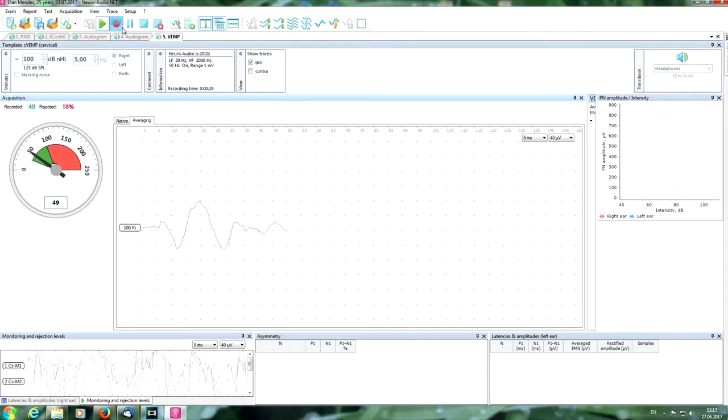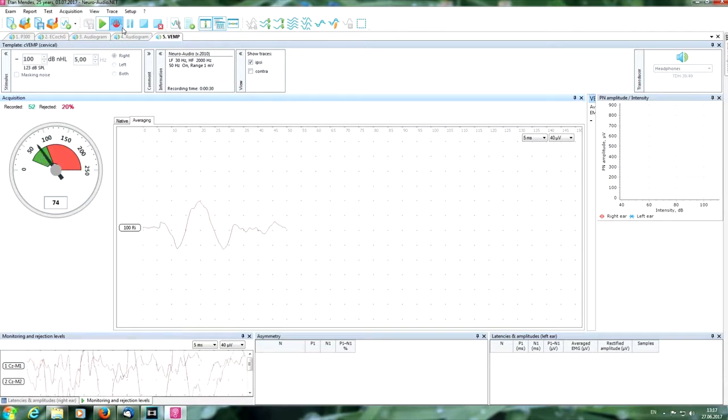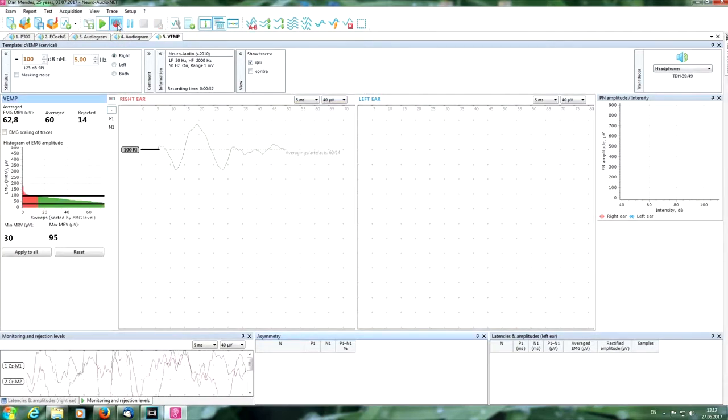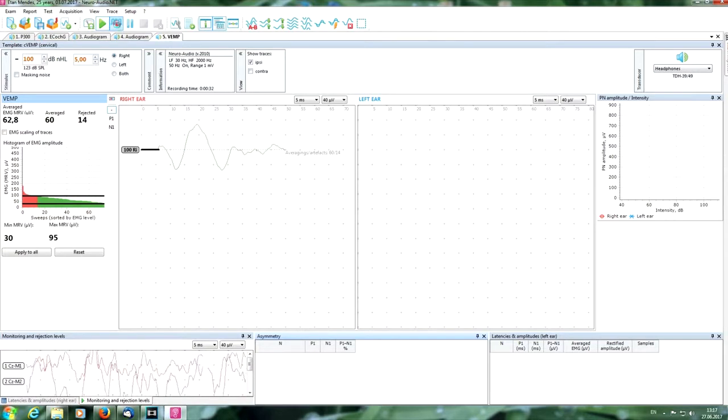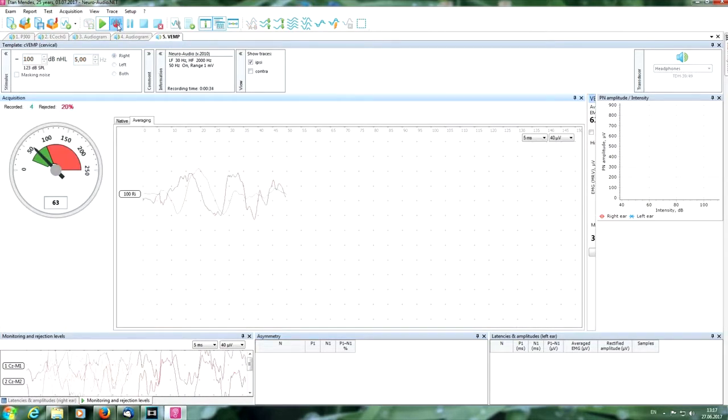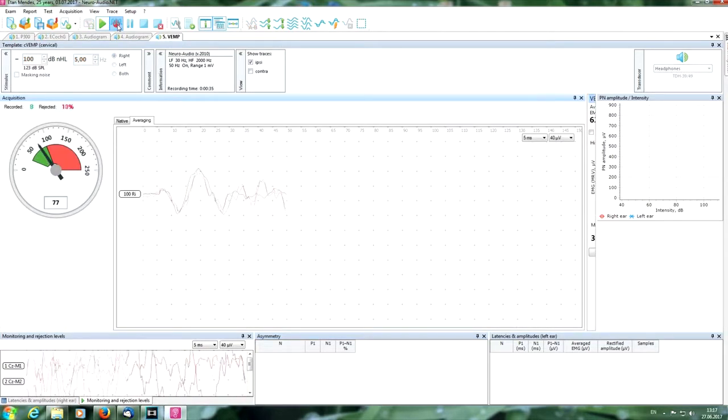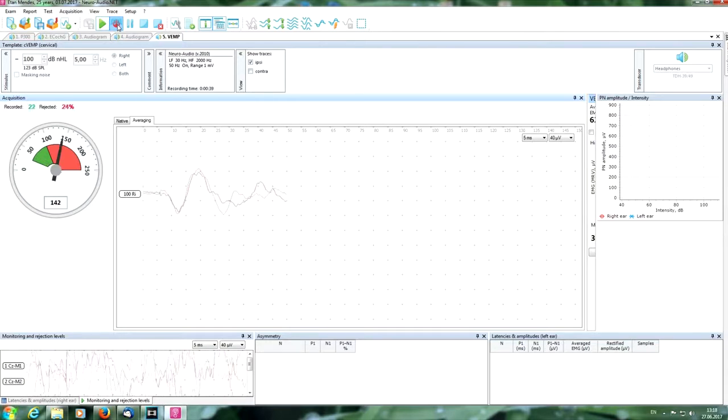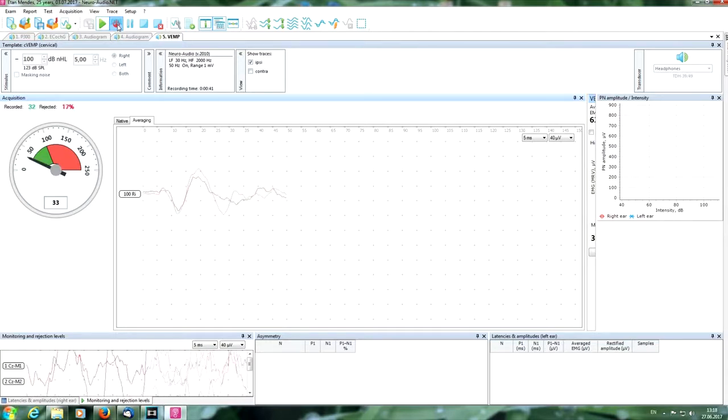Please contract, construct, yes, finished. Repeat to check the reproducibility of responses. We have a good matching as you can see.